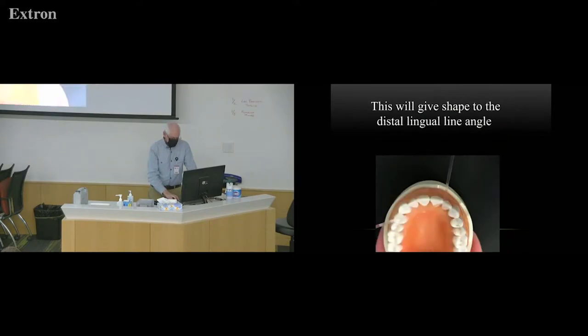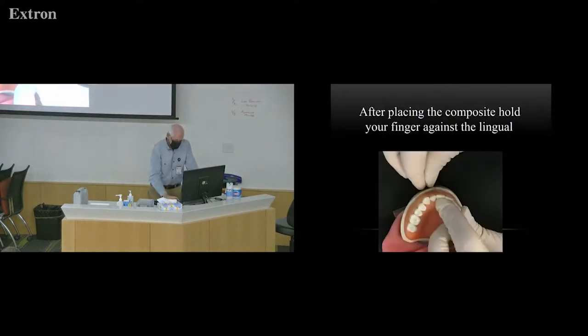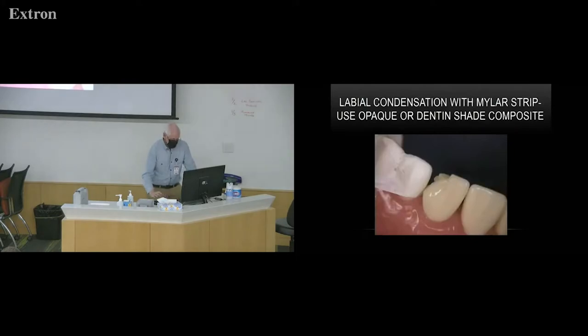Then place that in, and this is what is going to help you, after the composite is on the lingual, you can take your finger and push it up against the lingual so you don't have a lot of excess. So after you place the composite on the lingual, you just push your finger against the lingual of it. Now let's watch a video of that.